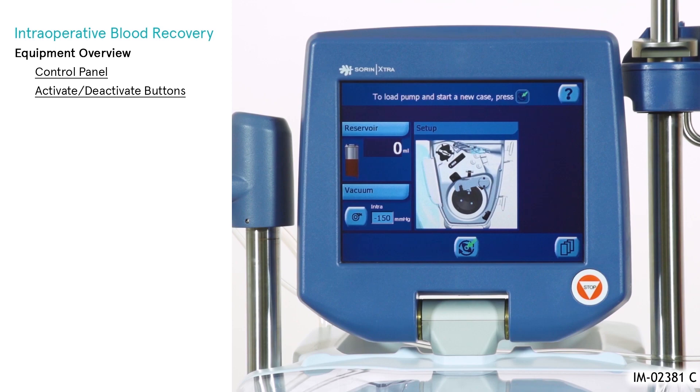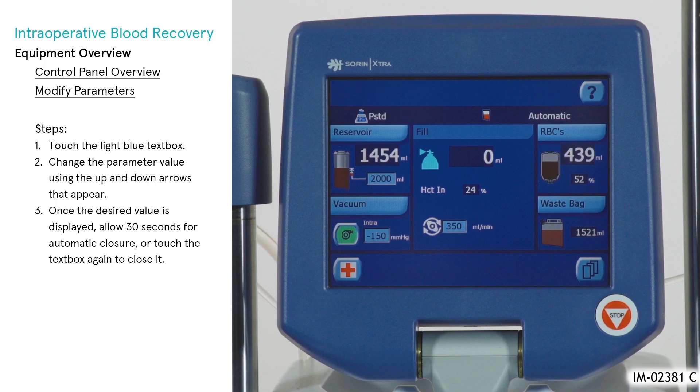To activate a function, press the associated button. If the function is to remain engaged, the button will illuminate green.